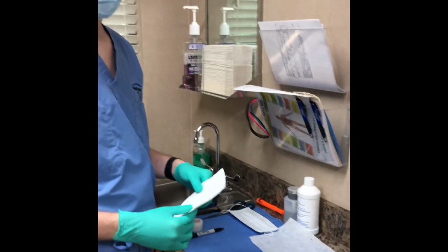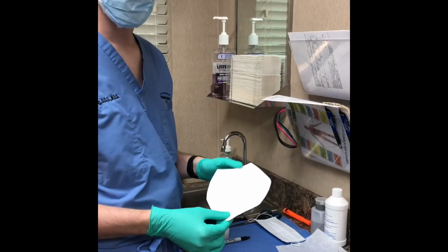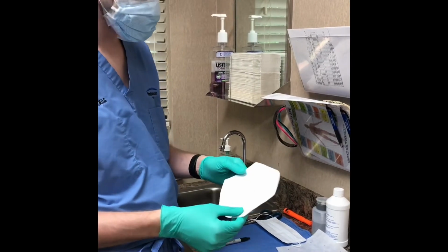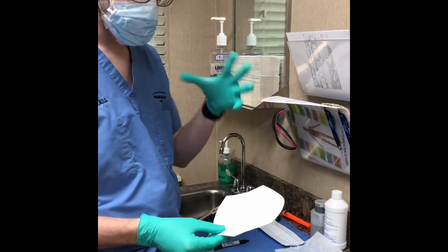Okay, so we're gonna make a mask. This is for sort of your base mask. It's got an interior liner that is gonna prevent basically viruses. These masks without it aren't that protective to viruses. So Dr. Craddock created a template of the material that we're gonna cut out and basically insert into the mask.